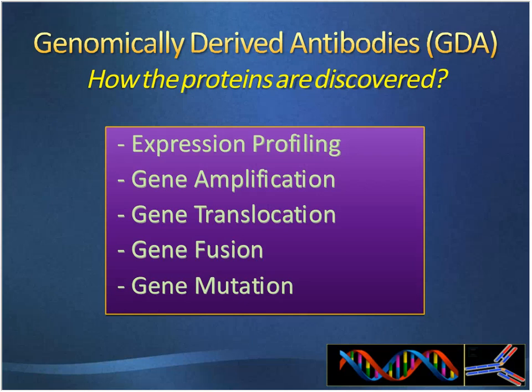The immunohistochemistry that we use with genomically derived antibodies, we have to know how these proteins are discovered first.